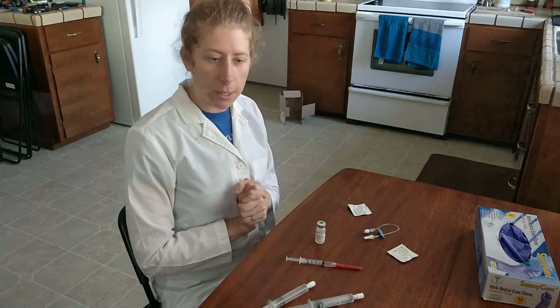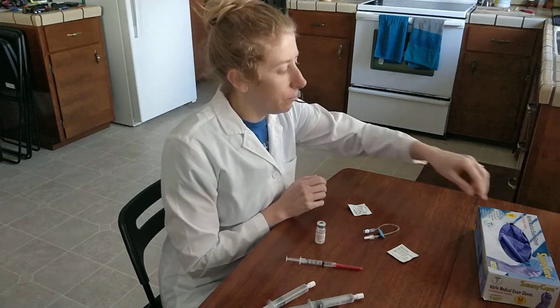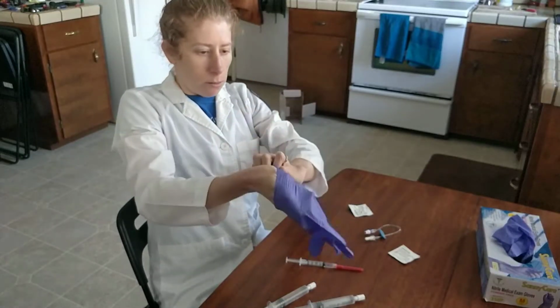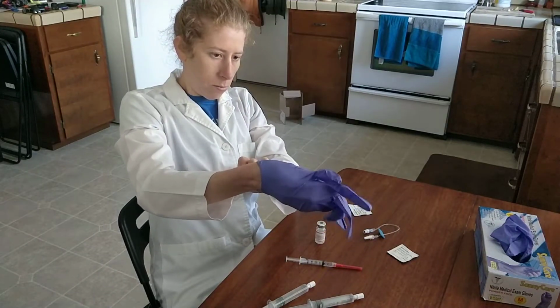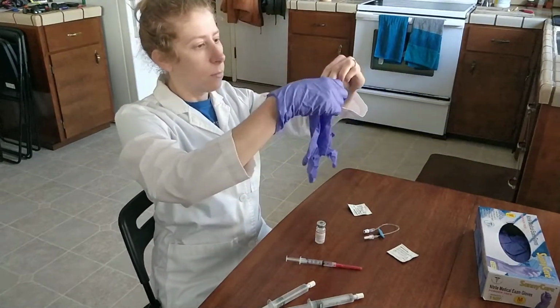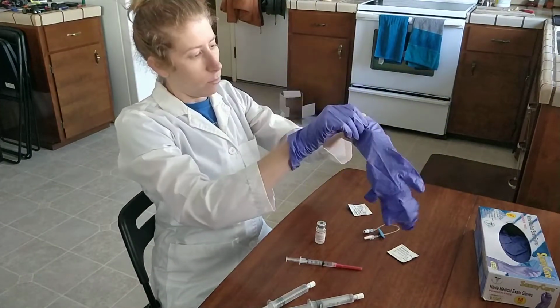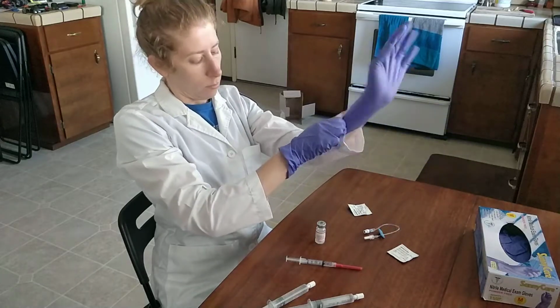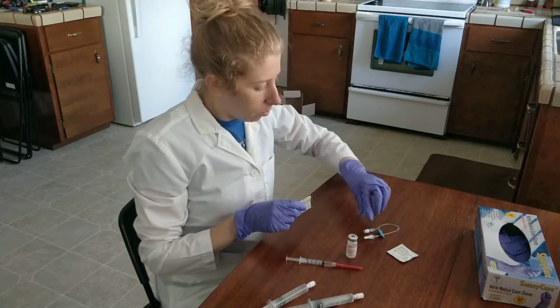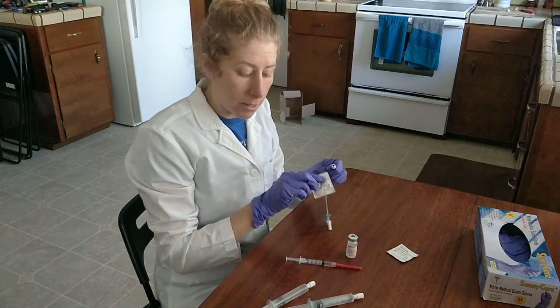If they don't refuse, perform hand hygiene, don clean gloves, then I am going to cleanse the INT port.